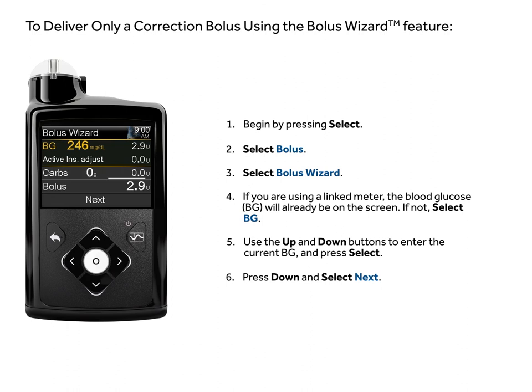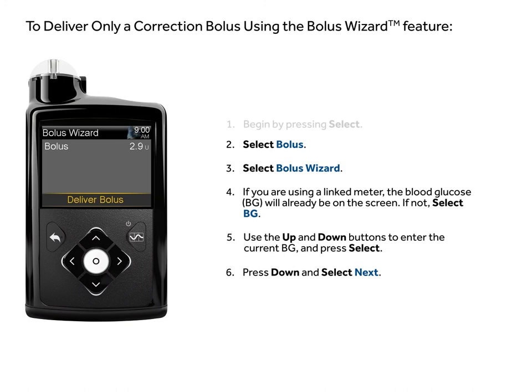Press down and select next. Select deliver bolus.